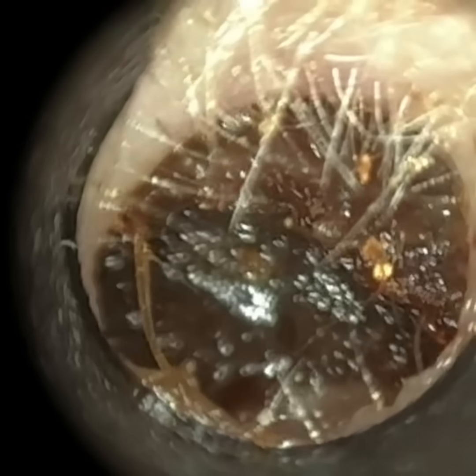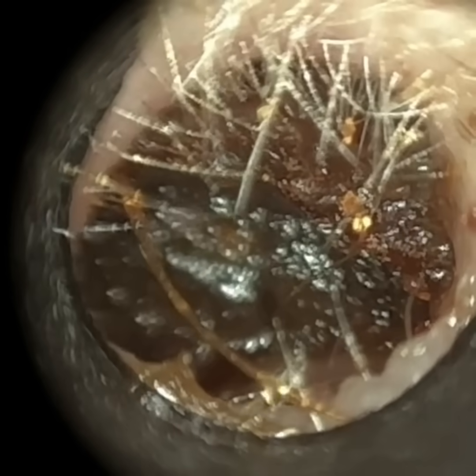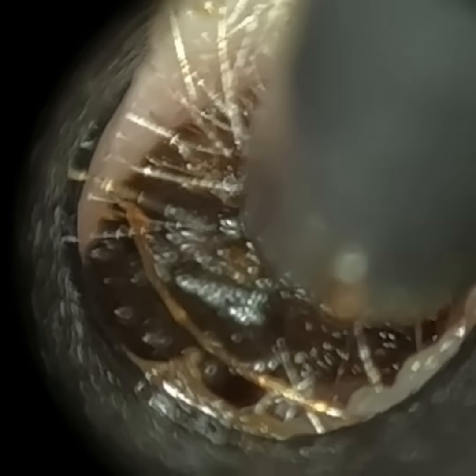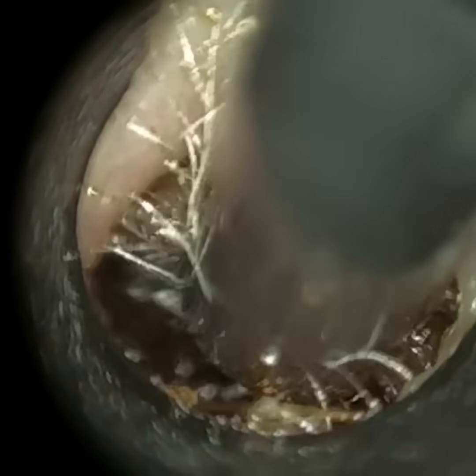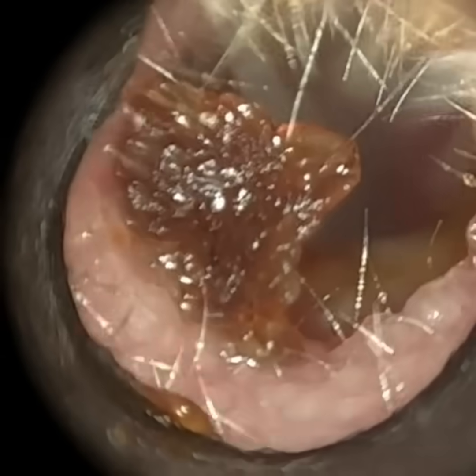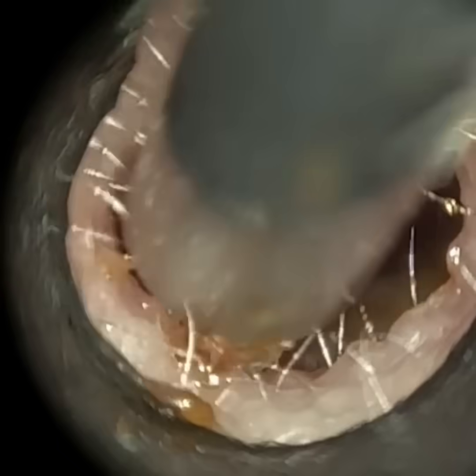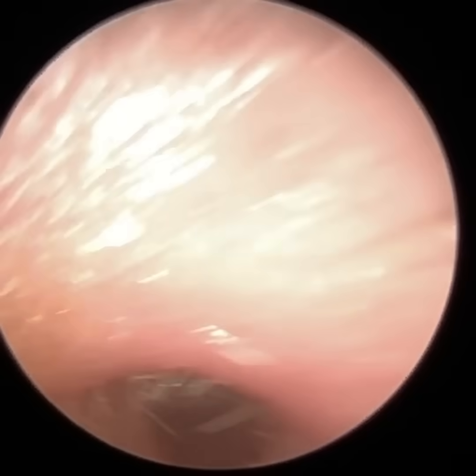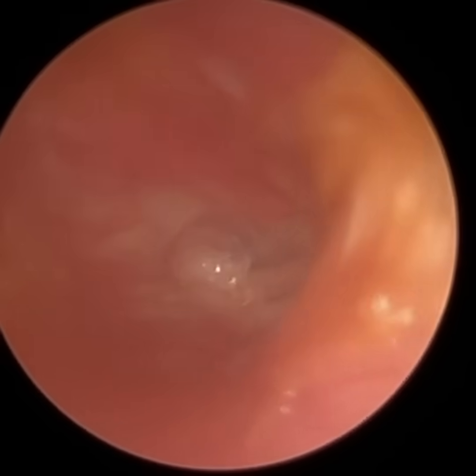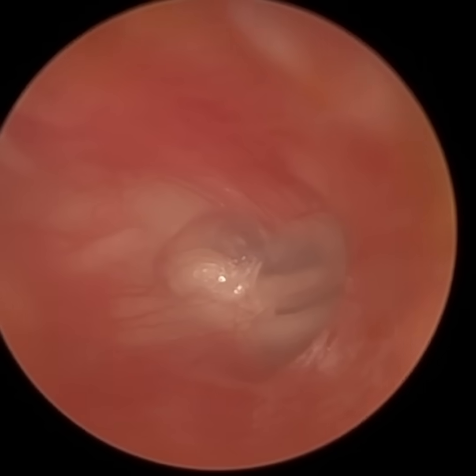So the fact that this patient heard it louder in their worst ear means that, again, they've got a middle ear problem. The middle ear is not functional, so that internal sound is getting trapped behind the eardrum and is being amplified and heard louder. I then positioned the tuning fork behind the ear on the mastoid bone. Sorry, I'm talking very quickly because I know the video is going to end soon. And then we positioned the tuning fork in front of the ear, and you should always hear it louder in front compared to the back. And this patient heard it loud at the back.